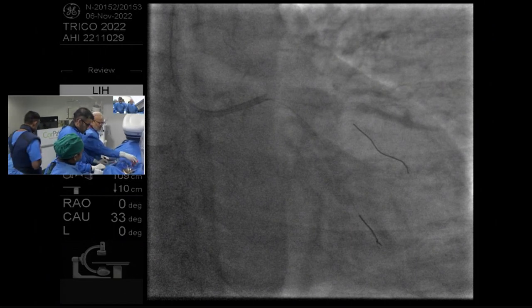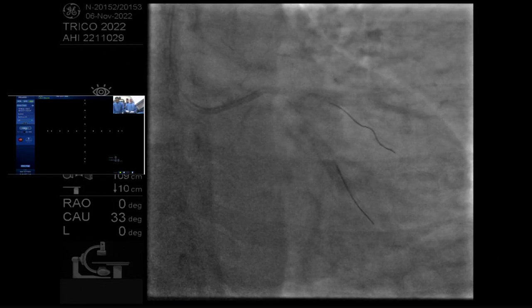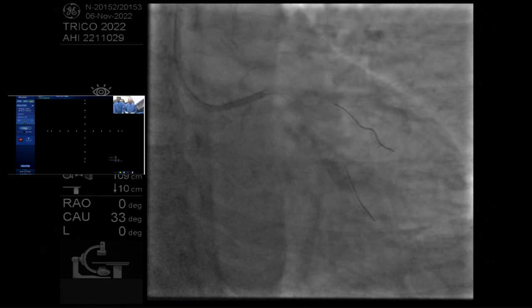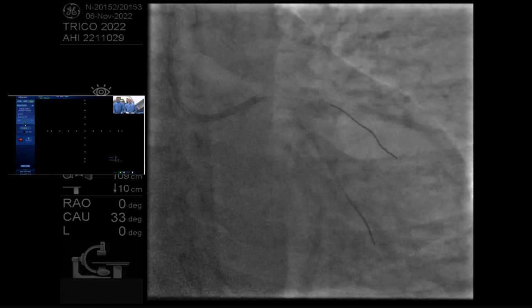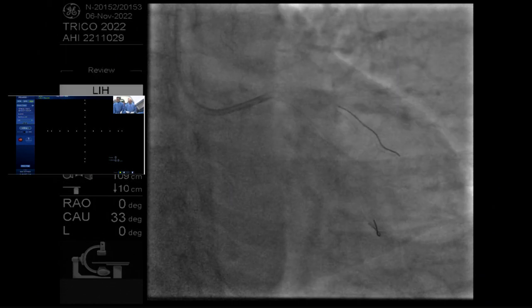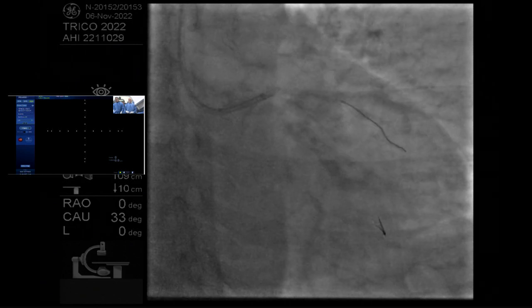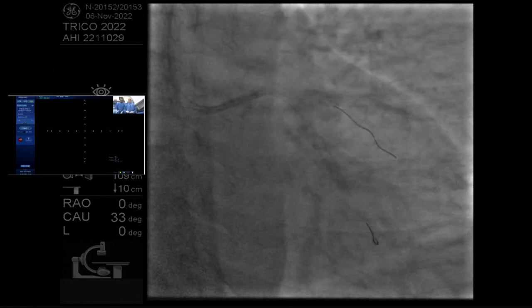So we've done zero contrast PCI. I think it's an elegant technique. The one thing I would say is that I have a conceptual problem with it, because I believe that contrast nephropathy is a misnomer, and it's more embolic nephropathy. Yeah, that's another debate. Yeah, the zero contrast PCI are using the technique, the IVUS guiding, but I did not using the balloon inflated the lesion first.